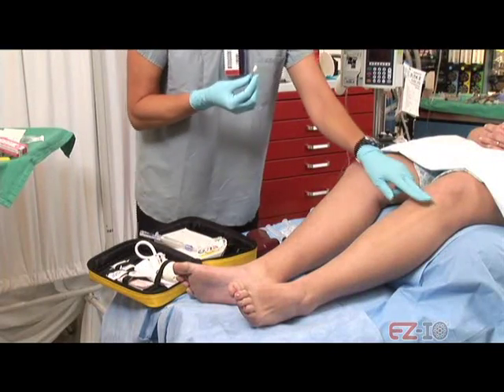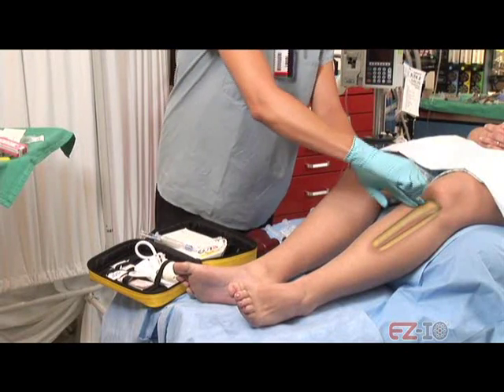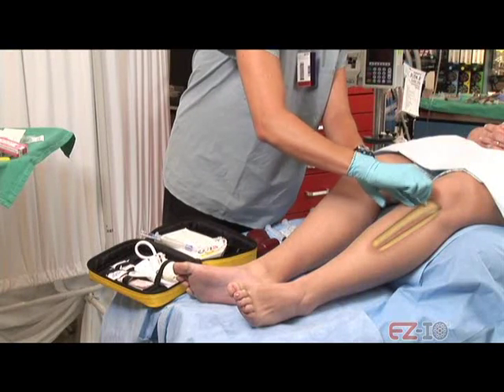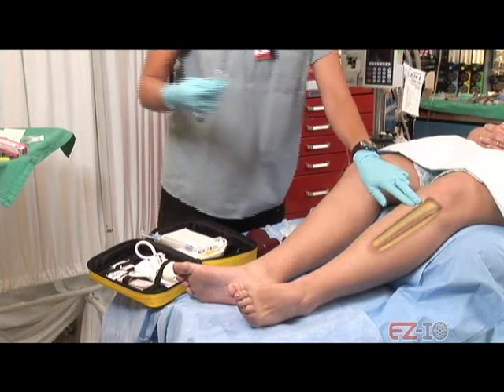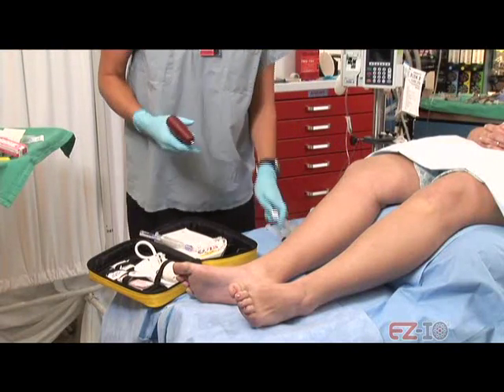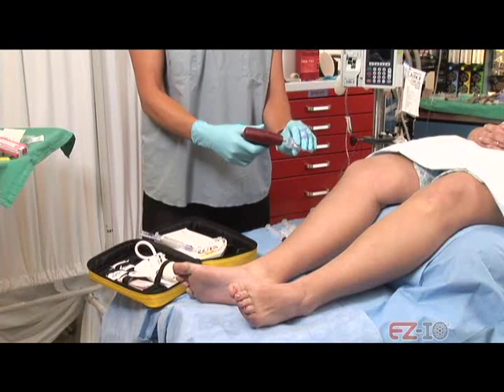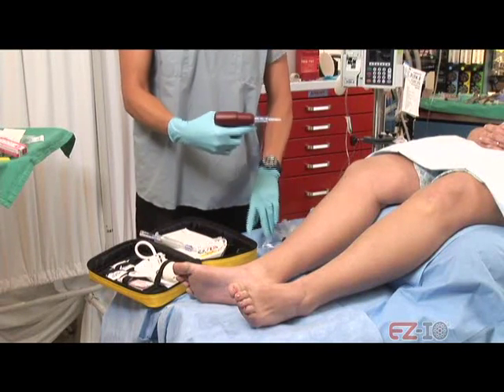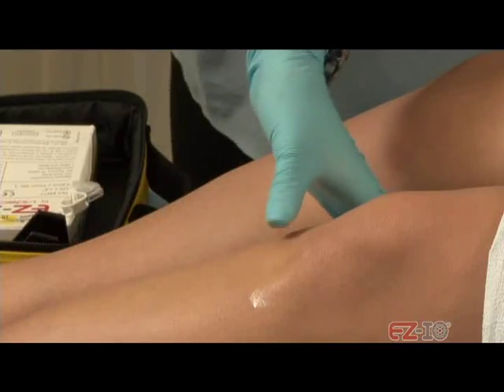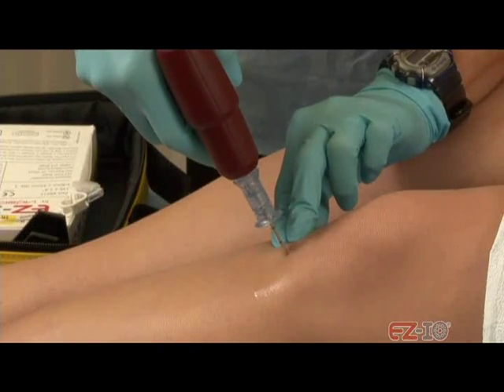Okay, now I'll let you know before I'm going to put it in. I'm just finding the spot where I'm going to put it. Are you ready? Mm-hmm. Okay, quick poke.